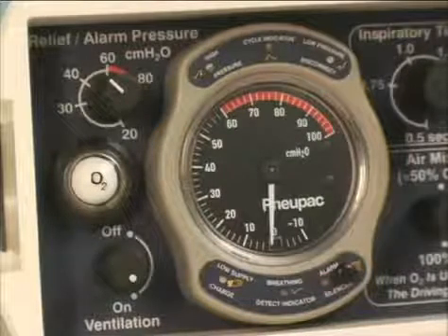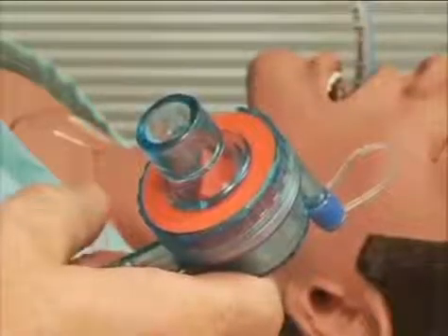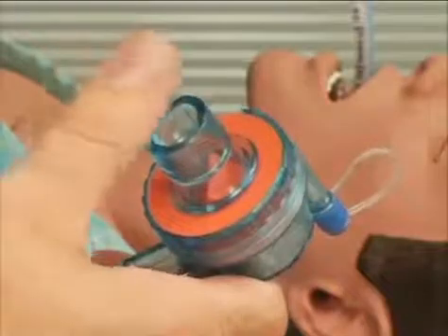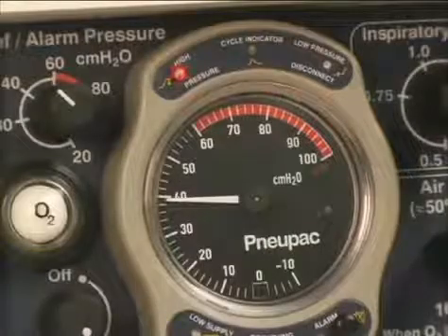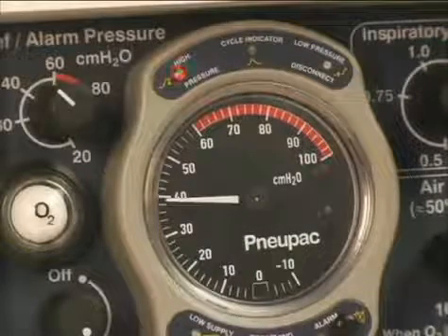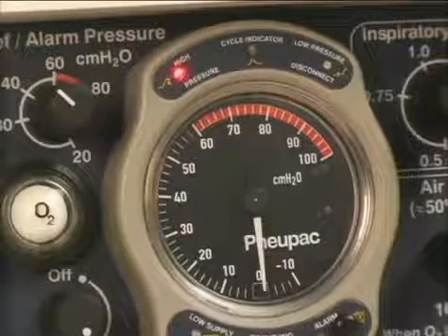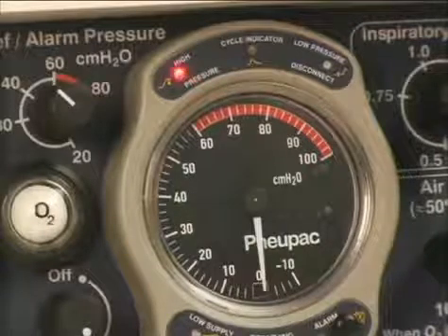Set ventilation parameters to suit the patient. Using your thumb, briefly block the patient connection port of the patient valve. Then check that the peak inflation pressure reading on the manometer is appropriate for the patient. Also, make sure the pneumatic audible alarm sounds and the high inflation indicator shows red.